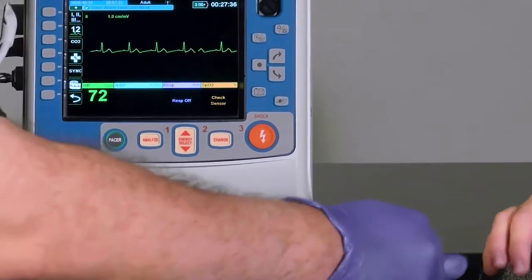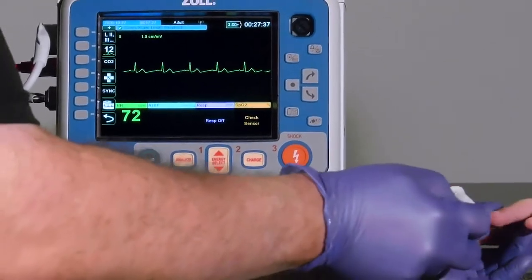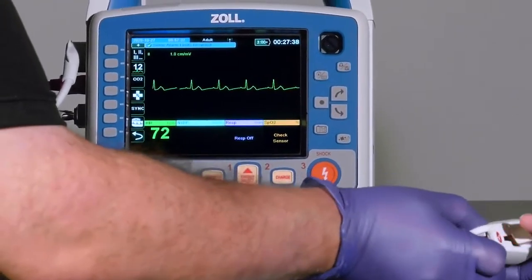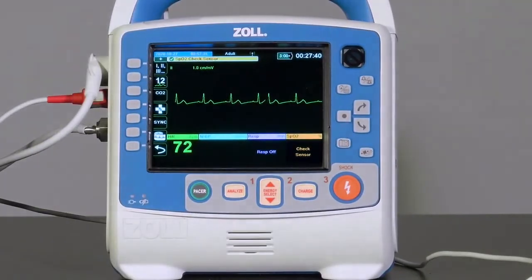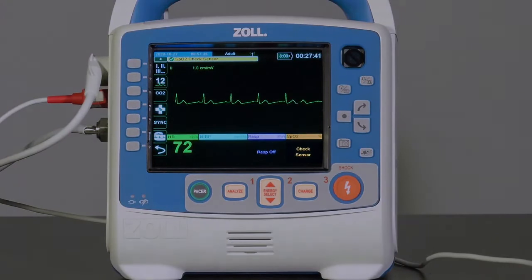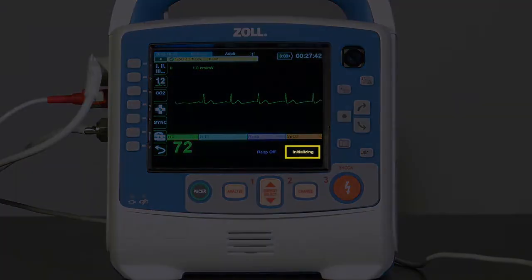When the connection is made between the sensor and the unit, the message "Initializing" appears in the display.